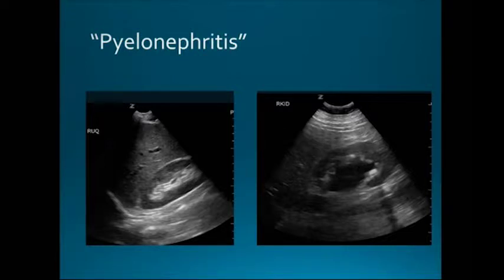So here's the peanut right here, here's the chocolate, and then here's the candy colored shell of the kidney. This is the middle of the kidney here. This is the collecting system of the kidney, and the collecting system is kind of dense and filled with this fatty tissue, and it's normally this brighter white, okay? When you lose that bright whiteness, when it becomes black, this black is fluid in the center of the collecting system. It shouldn't be there. And so this is what hydronephrosis looks like.